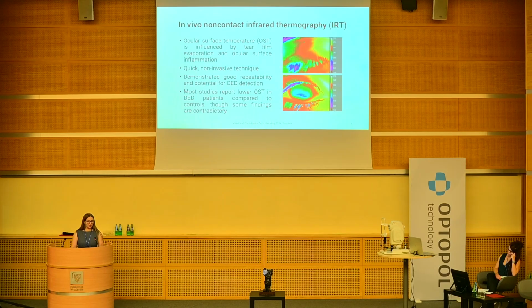Tear film thermography in dry eye disease diagnosis was published in some studies showing that there are differences between people without dry eye and with dry eye. However, until this moment, there was no study that would put them in order in terms of severity. It was like 1-0, and some of these studies even have different results.